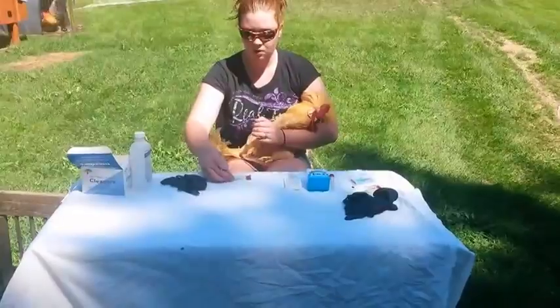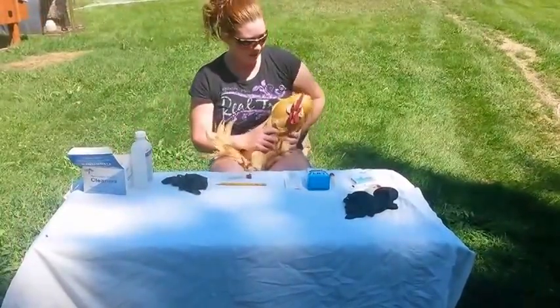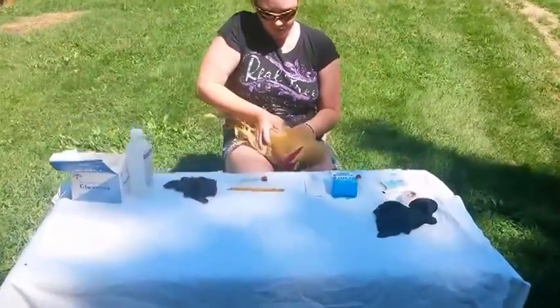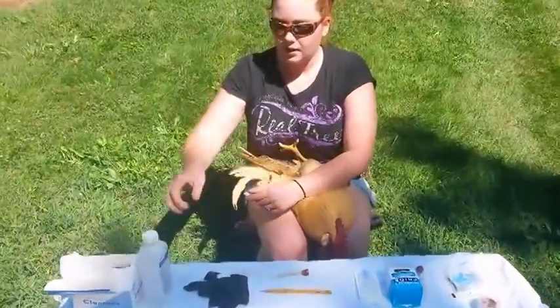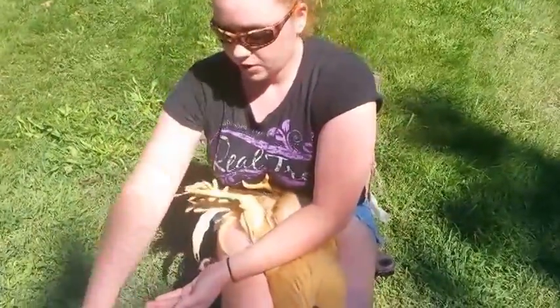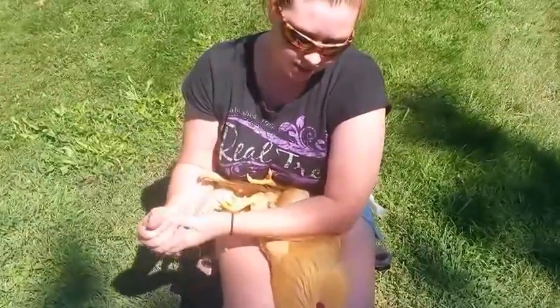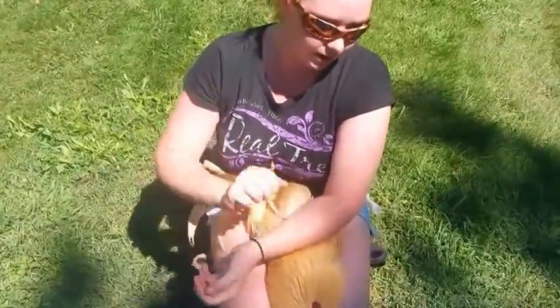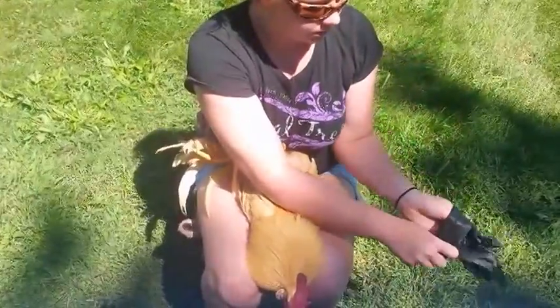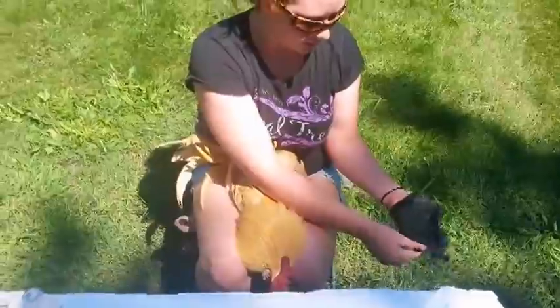I've broken down what his leg band is. Then I'll tip him to his side right here like that, and I'll sanitize my hands just a little bit to make sure that everything is clean — there's nothing that can get into the blood. You want it to be clean, you want the bird to be safe. Wear your gloves because you might have dirt or something on your hands; you do not want that getting mixed in.